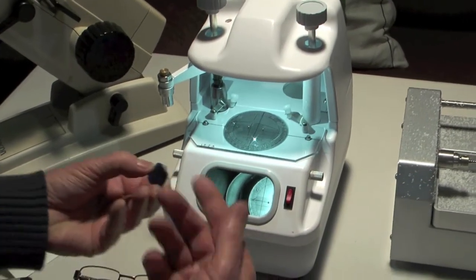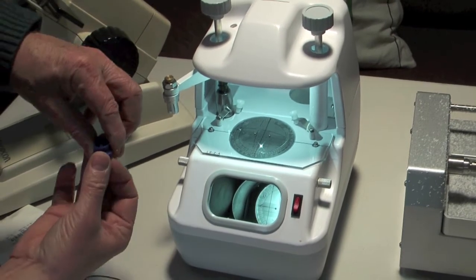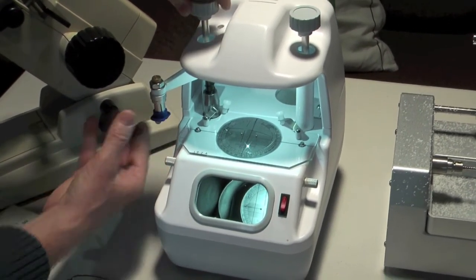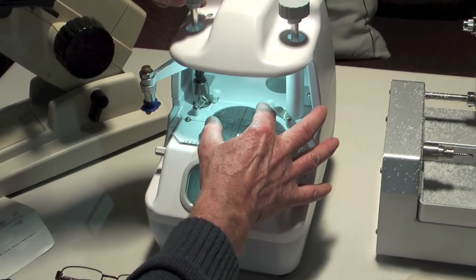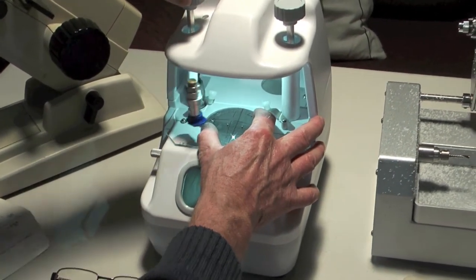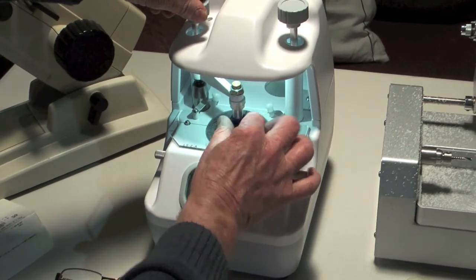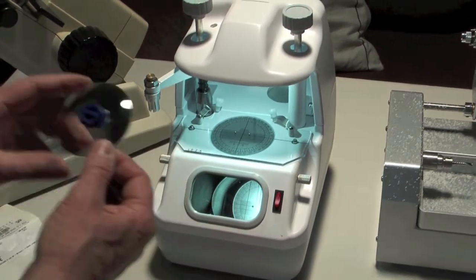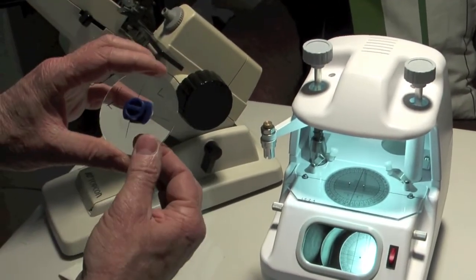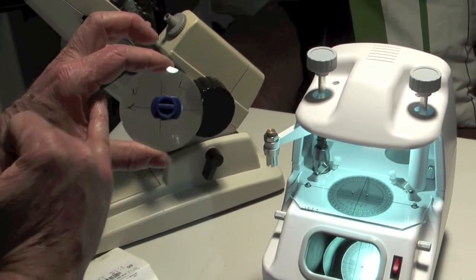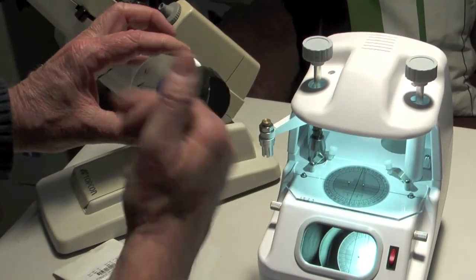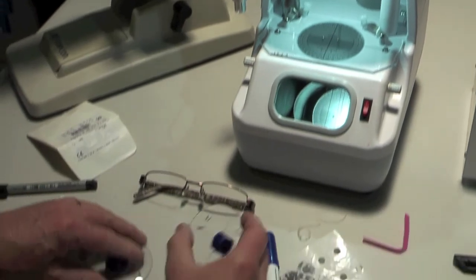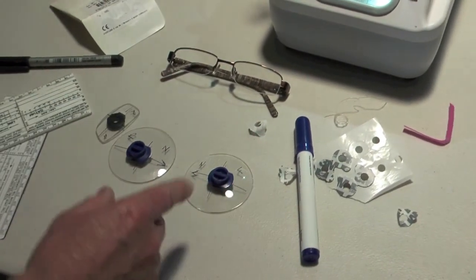So we're going to block up the left lens now. We put this on the machine and make sure that that's nice and in place, which it is. And that's great. So again, we have a lens that is being de-centered towards the nasal in the direction of the N by three and a half millimeters. So we've got two lenses now that are ready to be cut.